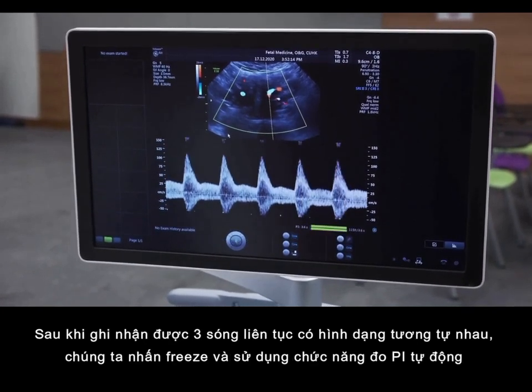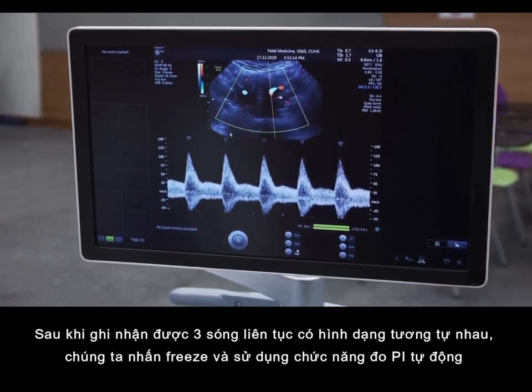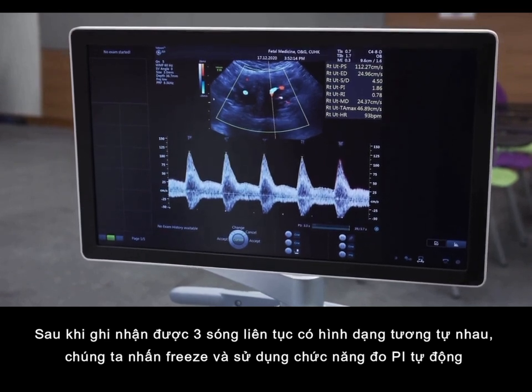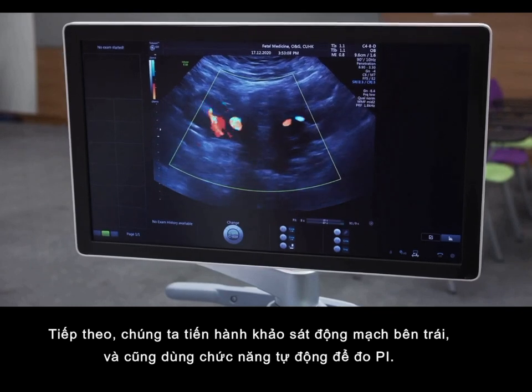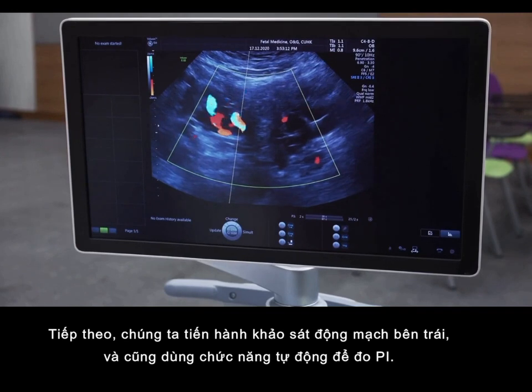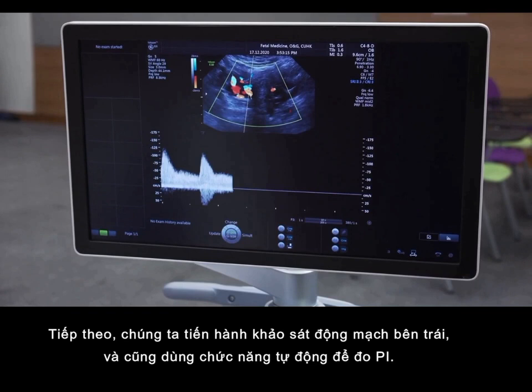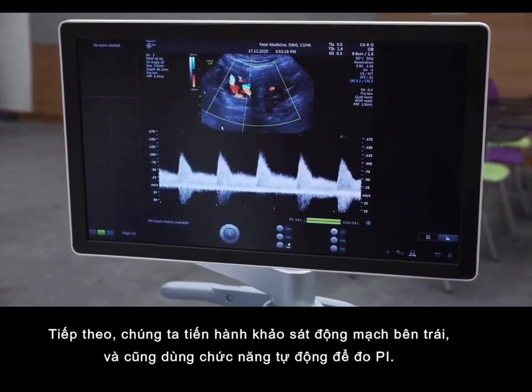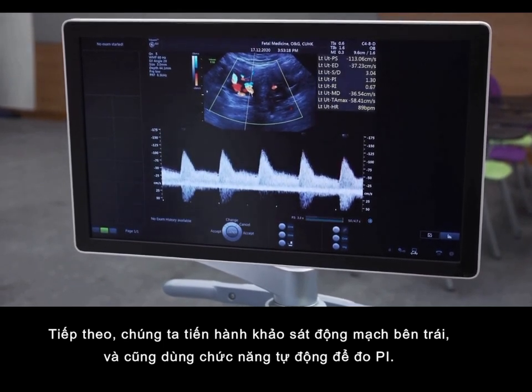And once you see 3 consecutive waveforms that are similar, we freeze the image and you use automatic function to measure the pulsatility index. So now we measure the left uterine artery pulsatility index. We use automatic function to measure the pulsatility index.